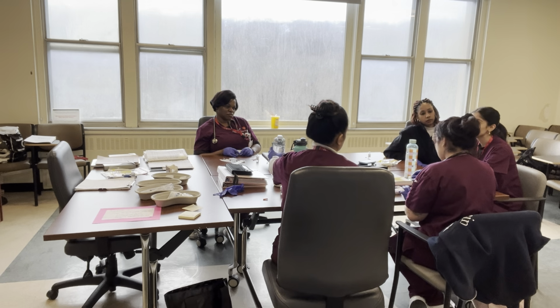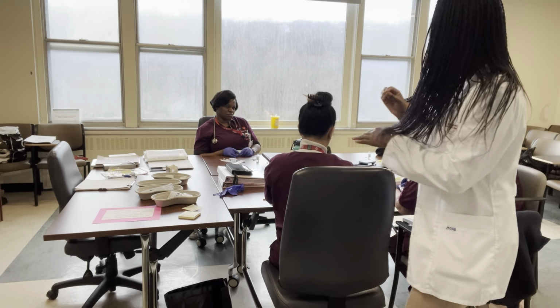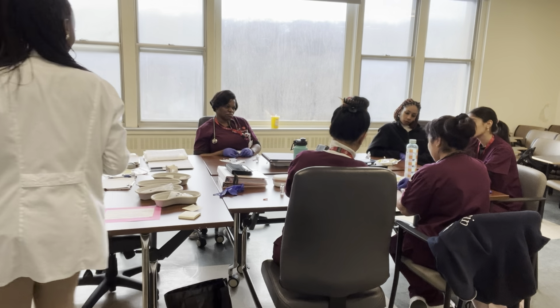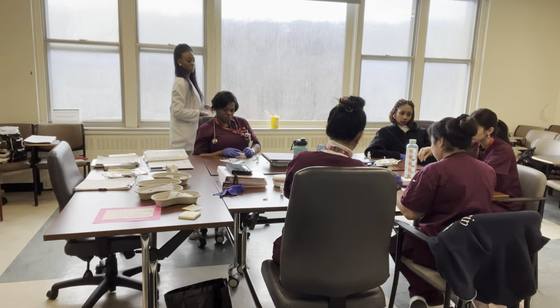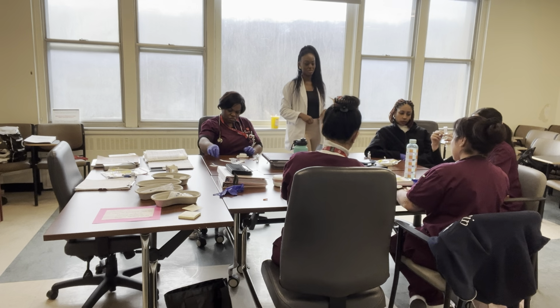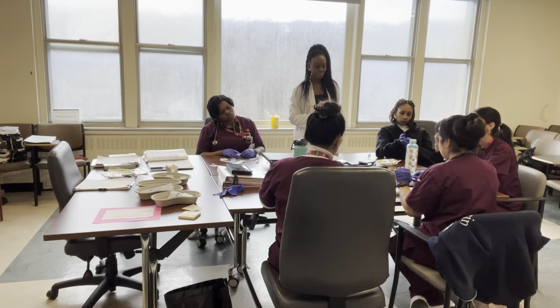And when I cover it, I'm gonna wipe the skin. I want you to actually wipe. It's not a fake wipe. That's how you wipe. You just dab. How did I do it? Okay. You actually disinfect. Beautiful. Then, oh, wait, before that I have to, yeah, 4 inches away, 2 inches away, sorry. 4 finger breadth. Okay.